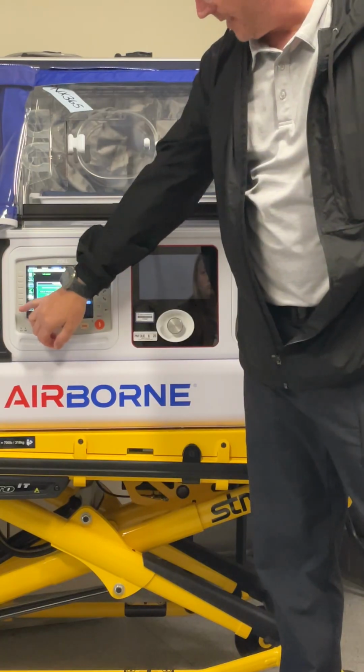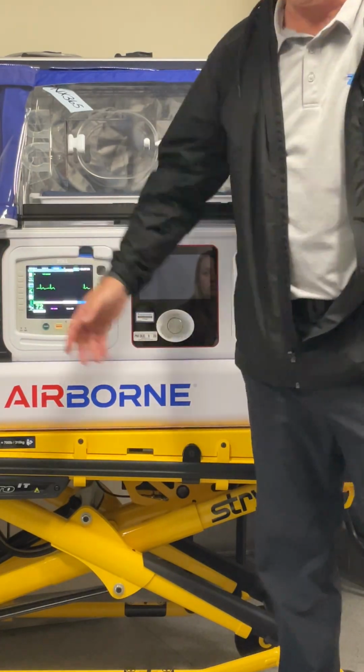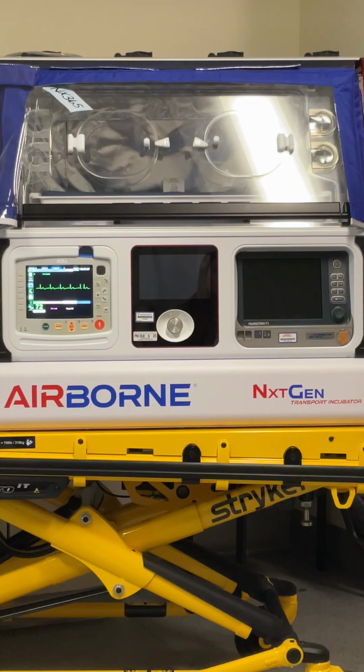The one underneath that, the envelope, is case push, so we can push it to some charting systems, not all charting systems. So we can push it to a charting system, and then you could bring it in that way. EMS uses it a lot.